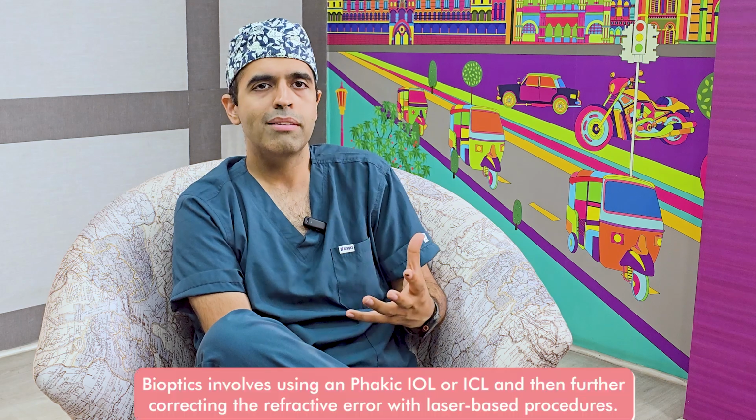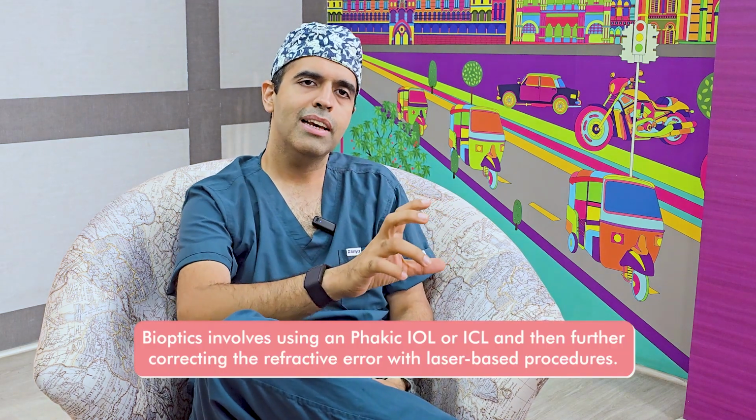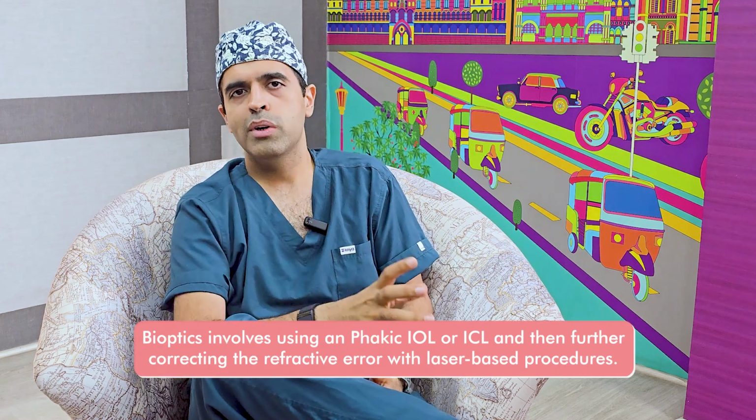We can do a combination of these two, known as Bioptics, wherein a patient who has a power above 20, let's say 25, 26, can be treated with a combination of an ICL as well as a laser. Let's say you can treat a -20 with an ICL and then a -6 with a laser. So -26 can also be treated with a combination of these.